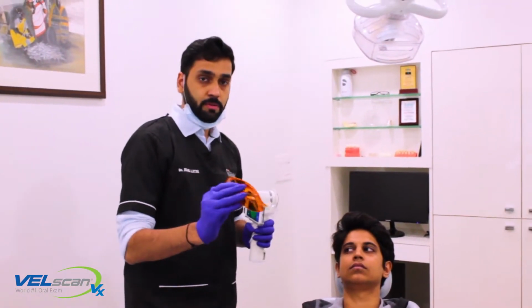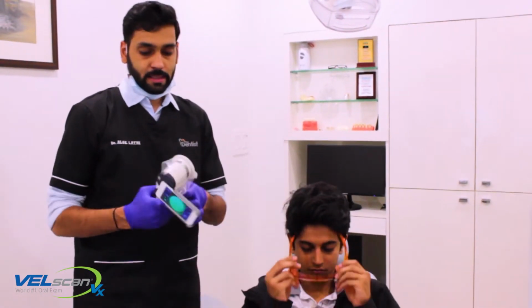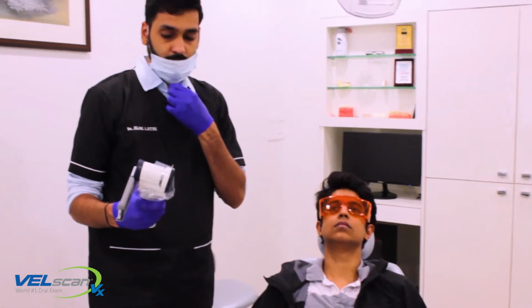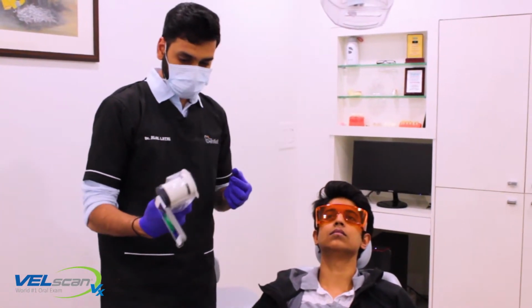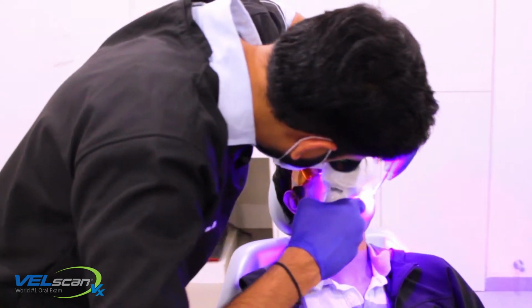And for protection of the eyes, we are going to ask the patient to wear this eye protective lens. So with this, when the doctor is ready with the mask and gloves as the normal protocol, we can directly assess the entire oral cavity.